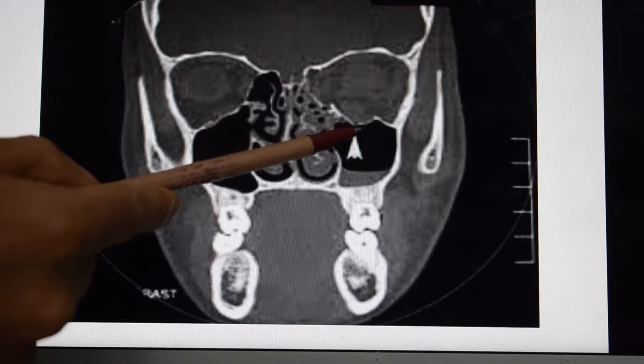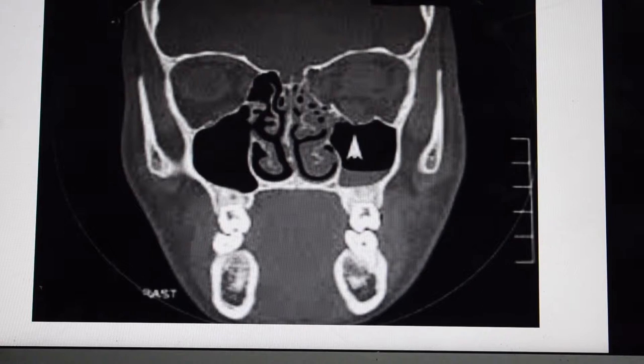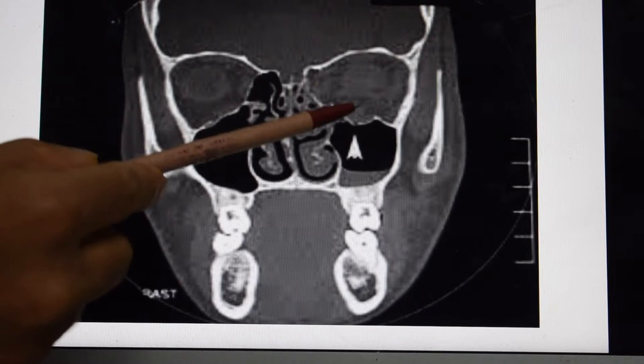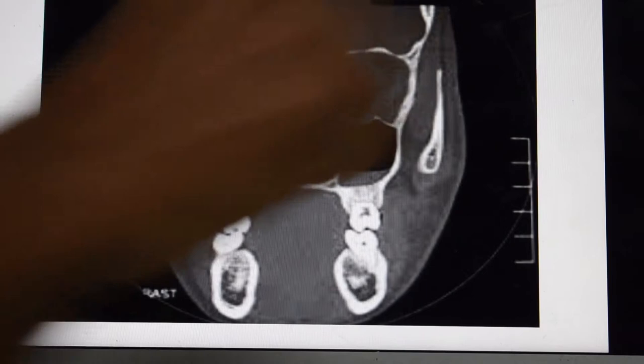These kinds of fractures we usually do not go for repair because they are undisplaced fractures and the patient does not have significant eye signs. If a patient is having eye signs like entrapment of the muscles, in that case we have to do plating of this area. Otherwise for this kind of fracture we don't go for plating.